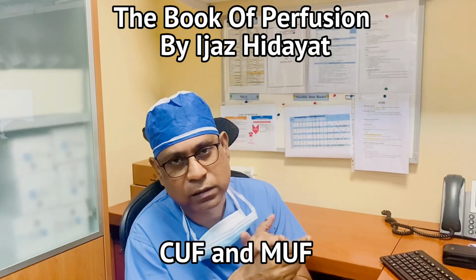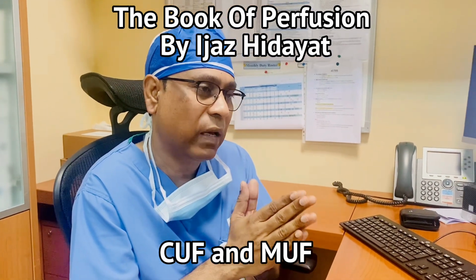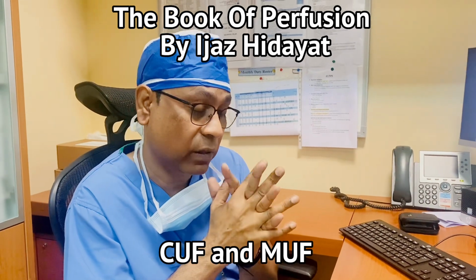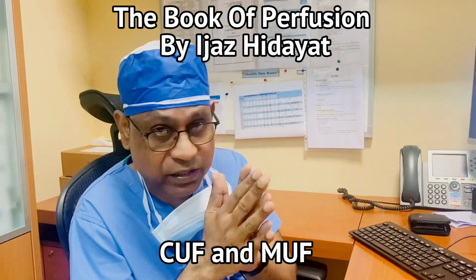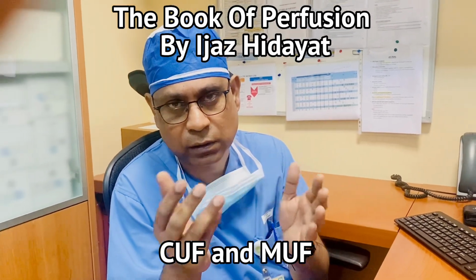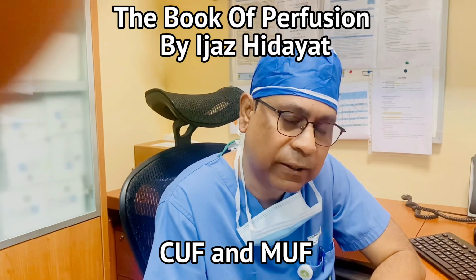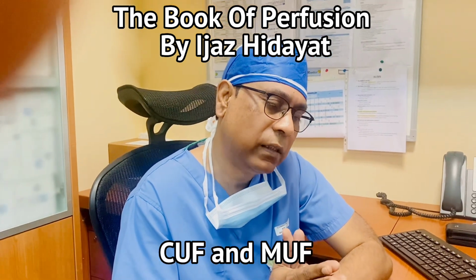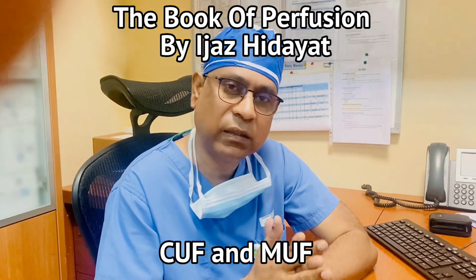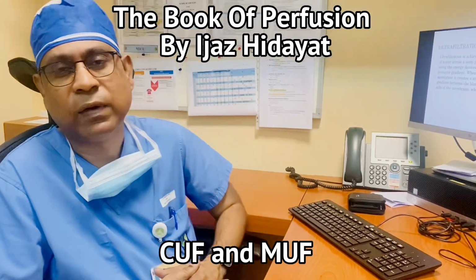Today's topic is ultrafiltration during cardiopulmonary bypass. Why do we need to do ultrafiltration during cardiopulmonary bypass, especially in pediatric surgery? Ultrafiltration is a process we use mostly in pediatric cardiac surgery, and there are two types of ultrafiltration. One is conventional ultrafiltration, and the other one is modified ultrafiltration.